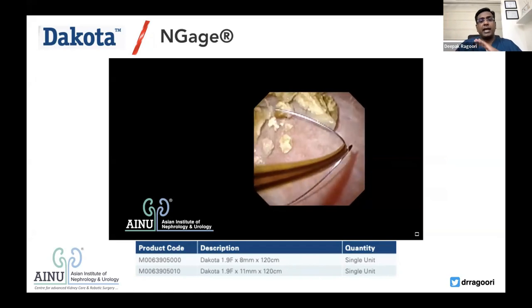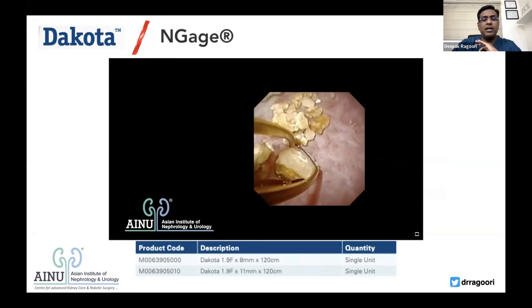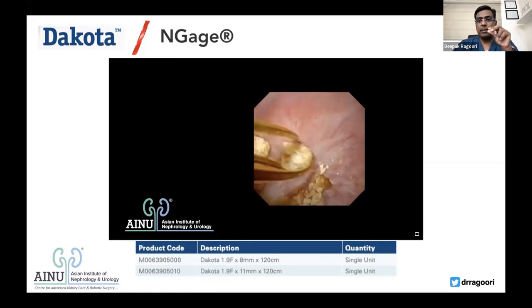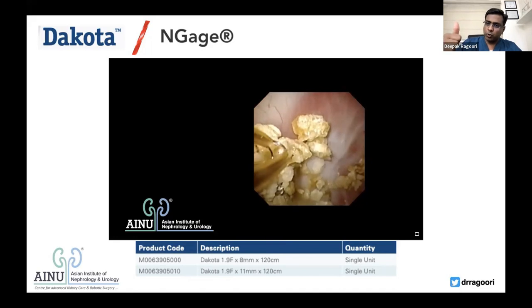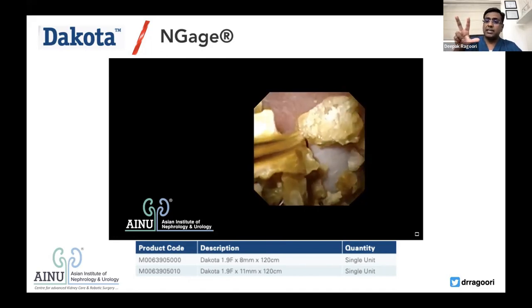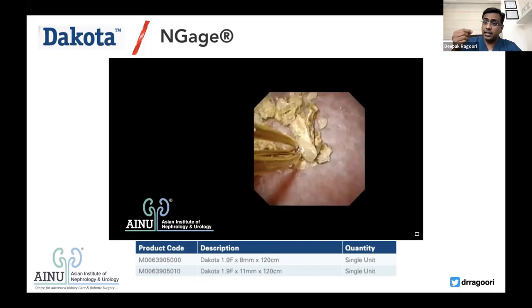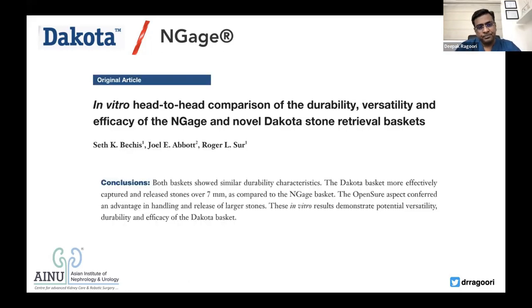So that gives you an idea of how an open-ended basket would help beautifully well, especially when you're working in a very close space, very close to the pelvicalyceal system. If it is a zero tip, which opens vertically, as the basket goes forward, your scope comes backwards. So that's where the advantage is to use an open-ended basket, so that you stay close to the stone with a very minimal space between the pelvicalyceal wall and the scope, yet capture the stone. That's the advantage in using an open-ended basket.